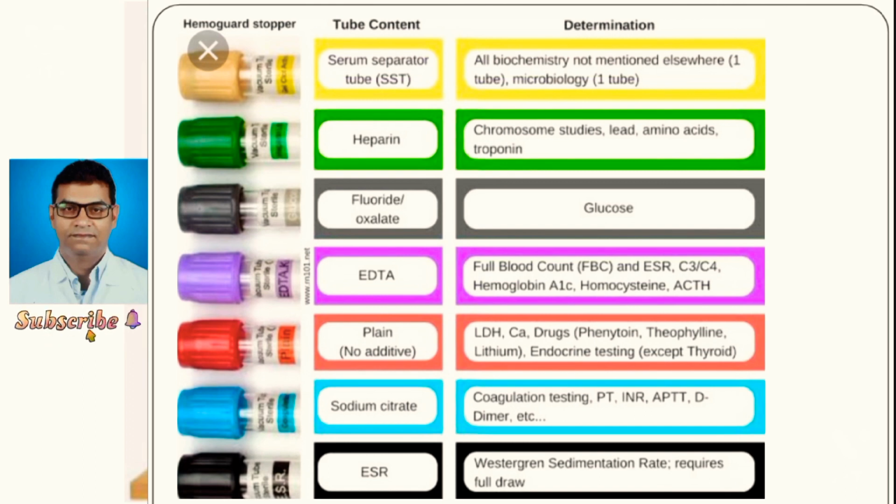Sodium fluoride. This anticoagulant is used for preparing blood specimens for the determination of glucose and urea in plasma by non-enzymatic methods. Fluorides inhibit the glycolytic enzymes and thereby prevent loss of glucose during transportation or delay in specimen handling. As fluoride is not a strong anticoagulant, it is mixed with the oxalates.